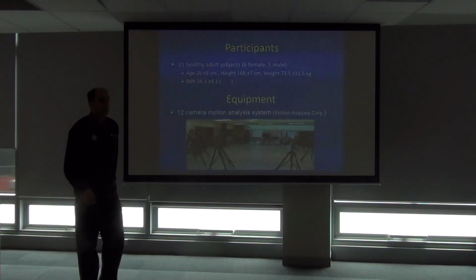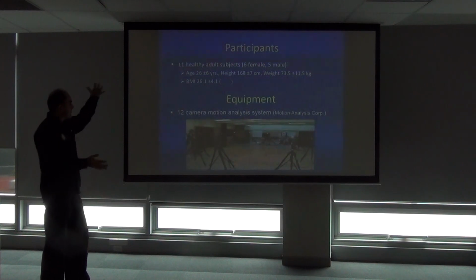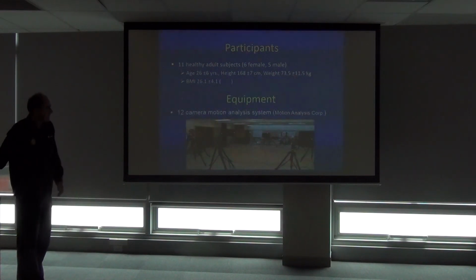Okay, so we've got to a reliability study. So we're going to make use of all this that we've looked at so far. Participants: 11 healthy subjects, mix of male and female, 12 camera motion analysis system, fairly standard, or these days it is.